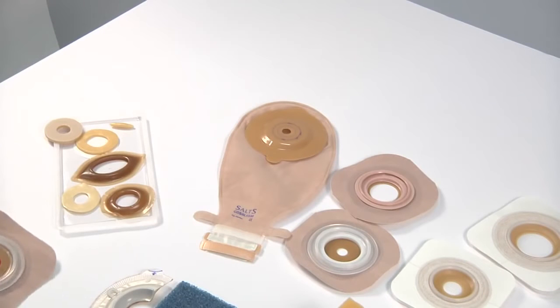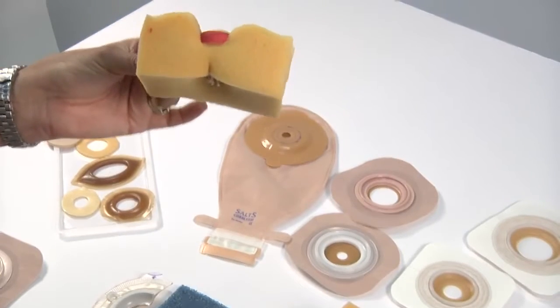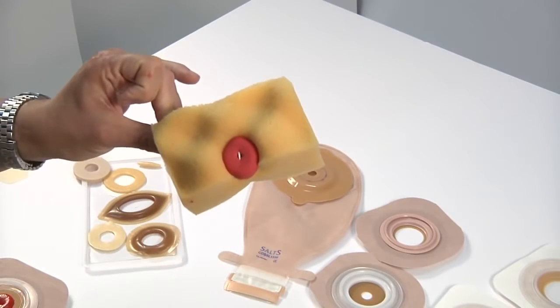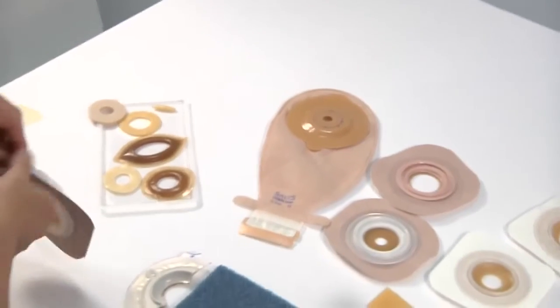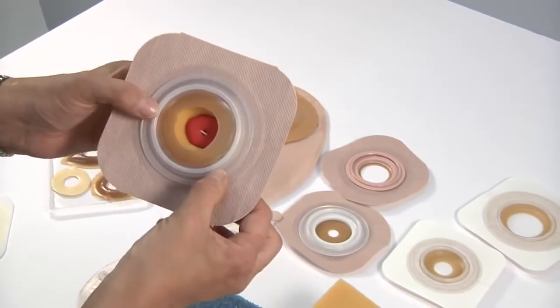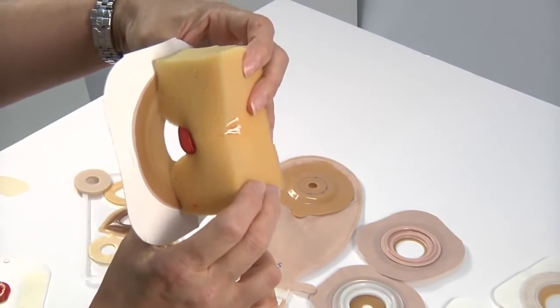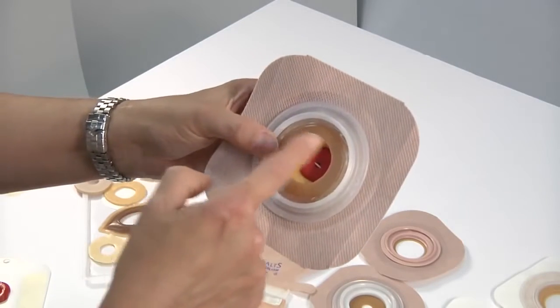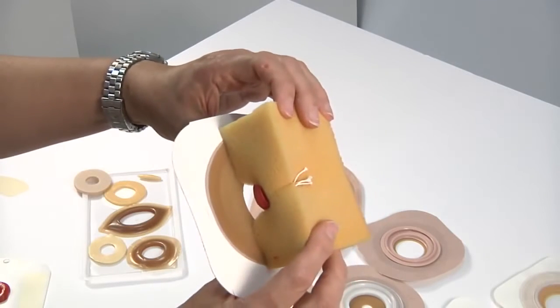When you have a less than ideal circumstance, I'm going to bring up this as an example, you still may have a protruding stoma and the opening or the os is at the center, but now you've got all of these valleys and ridges around it. If you take your flat pouching system and apply that over top of it like this, you can start to see from the side, from the profile, that you actually have a gap or a gully, and that's a place for the stool or urine to collect and cause undermining, and you're not actually protecting all of the surrounding skin.